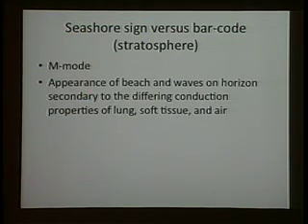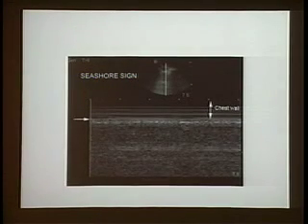So what you do is the same image acquisition that you're doing with your linear probe, and then you turn on your M mode, okay? So look at what's happening here. Rib, your parietal pleura there, you get your M mode activated. And now look what happens here, okay? The tissue that doesn't move, which is your skin, fat, all those structures, basically generates little lines over time. They're not moving, just a line.